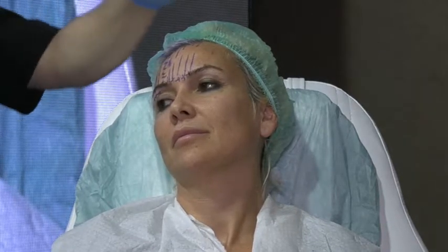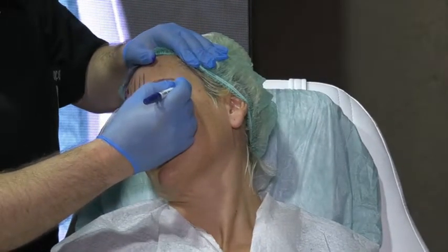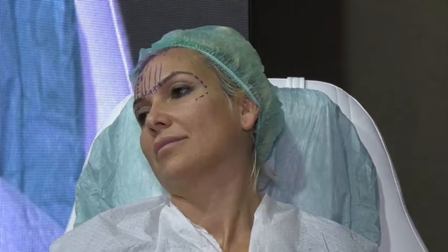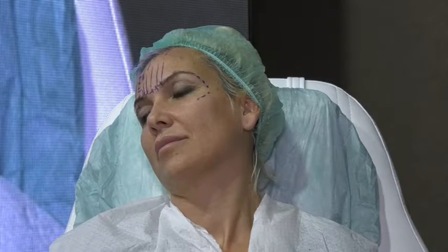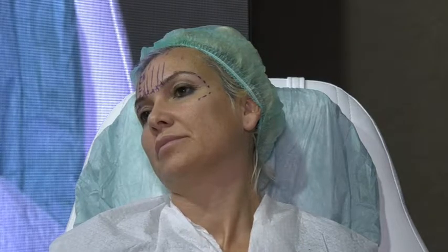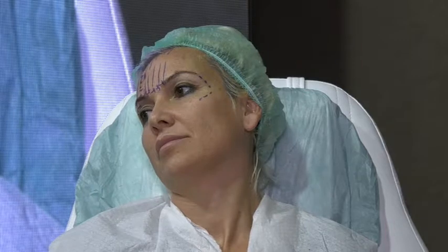That's what I want. You have to look at the lateral part of the eyebrow. You have to do a semicircle, continue like that, because this is my entry line. I will do something called the sun rays technique. What does it mean, sun rays? The sun is going that way. So you will go from narrow angles to wide angles. That means, look.